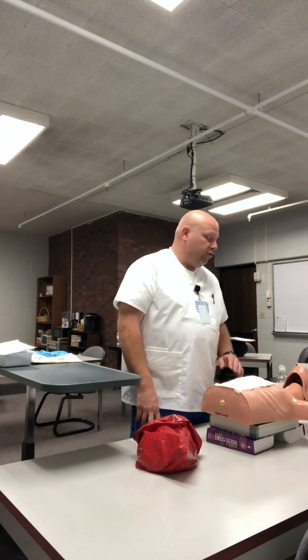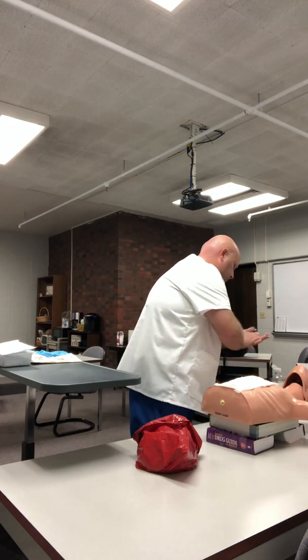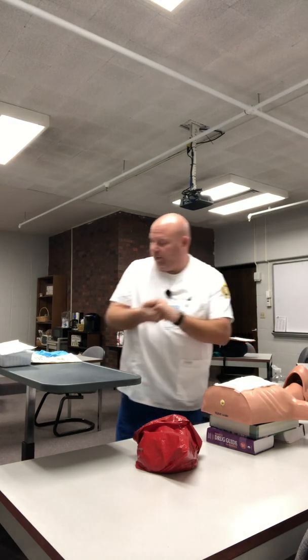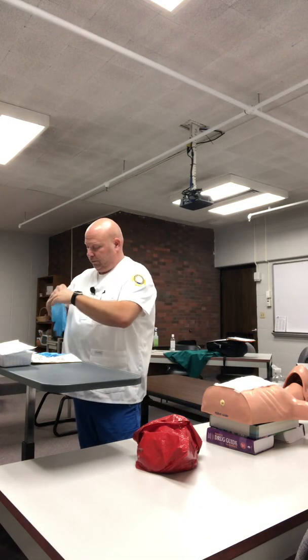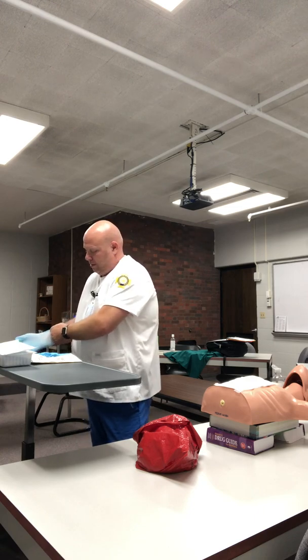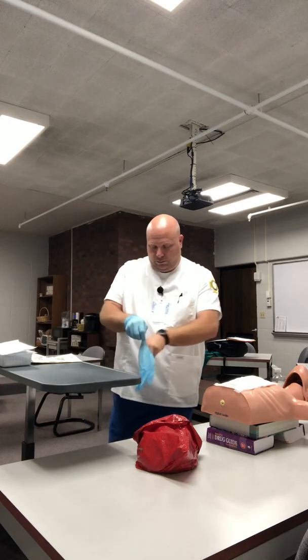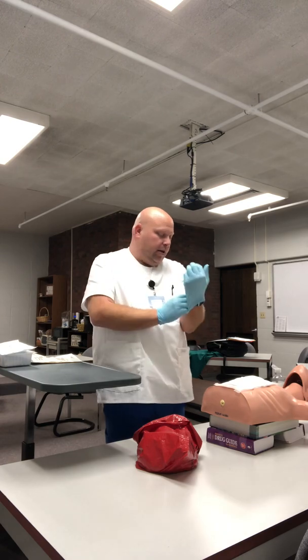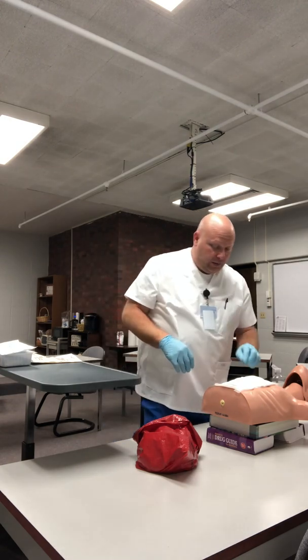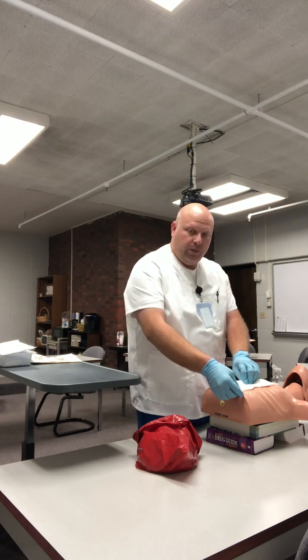So I'm going to change this dressing today. I'm going to perform some hand hygiene here real quick. Okay. We'll put my gloves on. Now when I take off this bandage, I'm going to hold a little bit of pressure here in the middle just to keep it from moving.